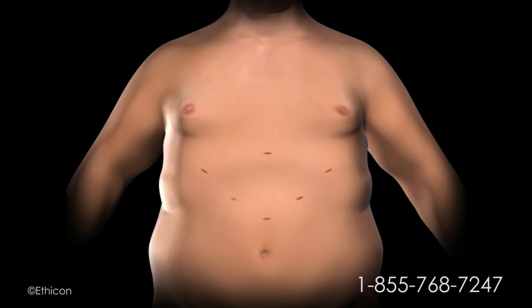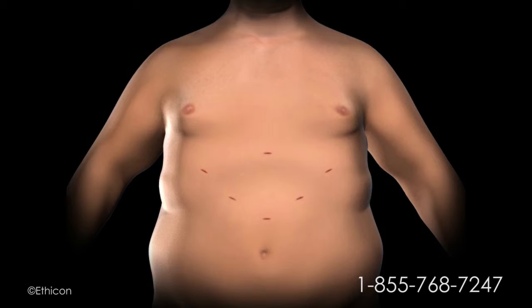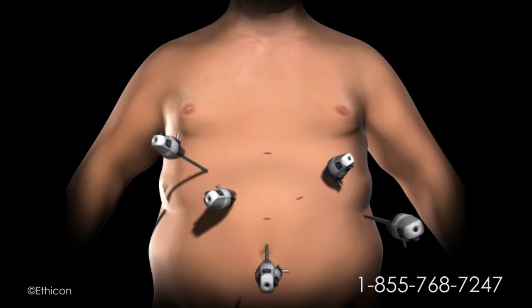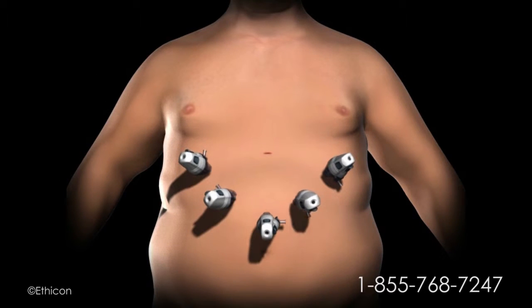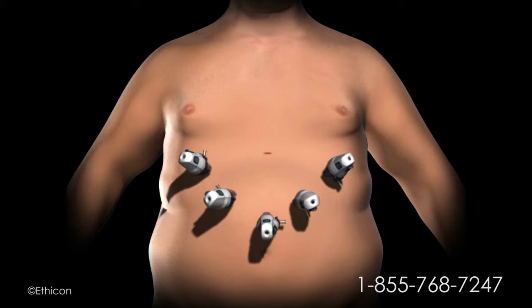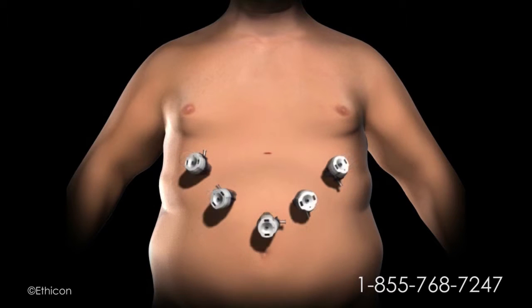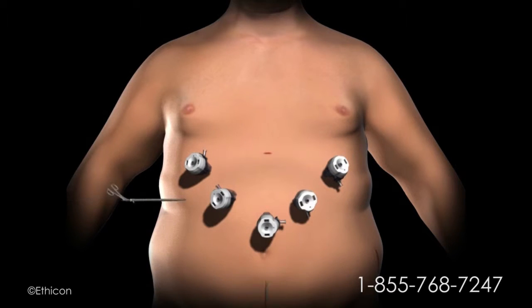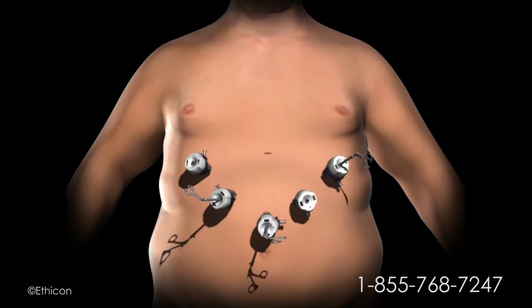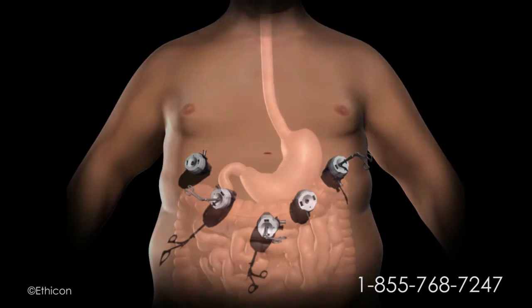To gain access to the abdominal cavity, small incisions are created on the abdomen. Trocars, which serve as passageways for the surgical instruments, are placed into the incisions. The surgical instruments are passed through the trocars to access the abdominal cavity.